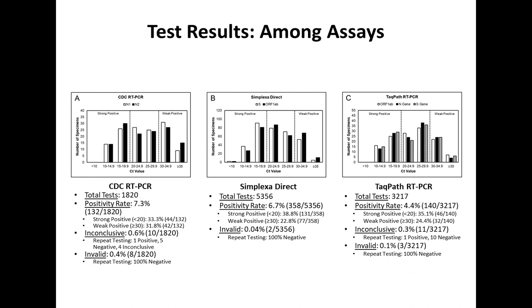You can see in the graph, we divided them up by number of specimens and then really started to look at overall CT values for our patients. Are we seeing CT values skew depending on the gene targets, right? This is really important because if one assay looks at the S gene and one assay looks at the N gene, potentially they don't have the same level of sensitivity for figuring out whether the virus is there.